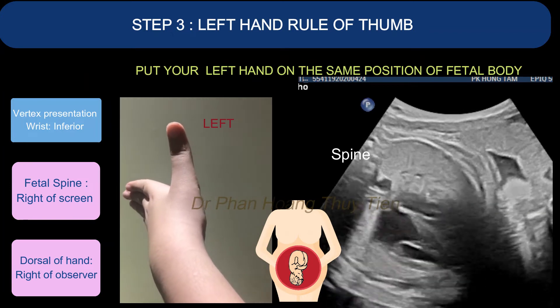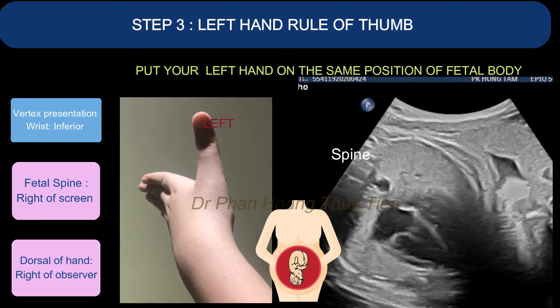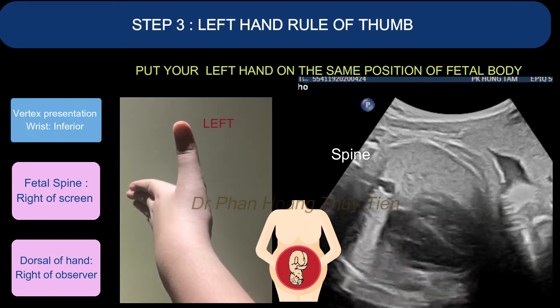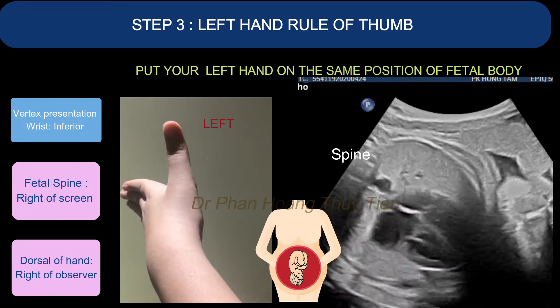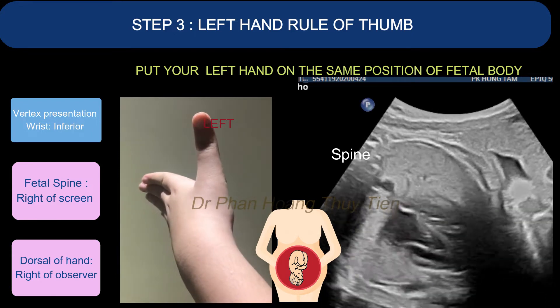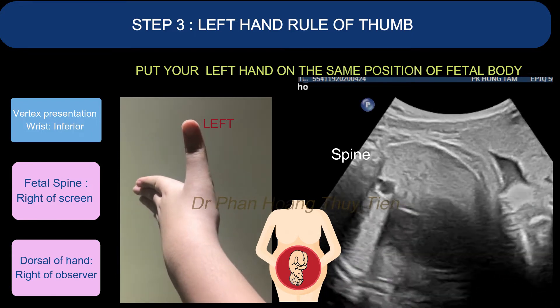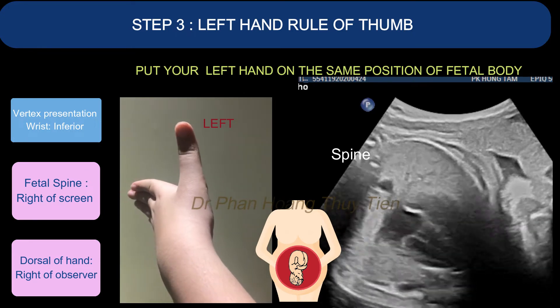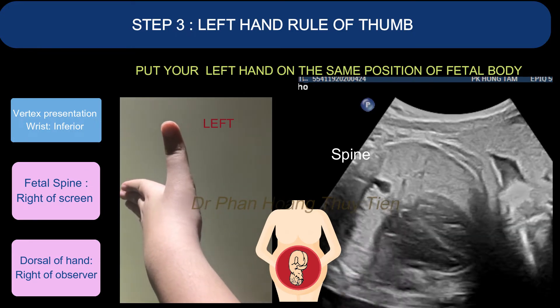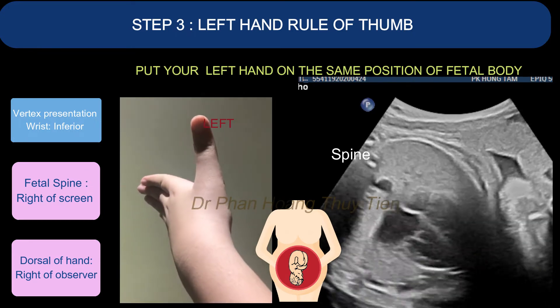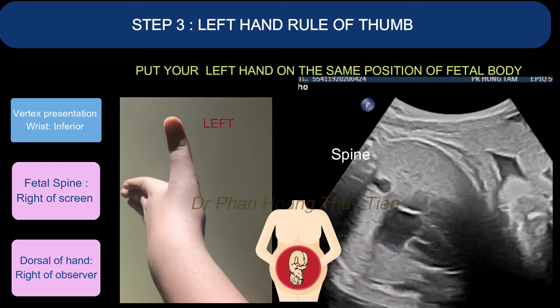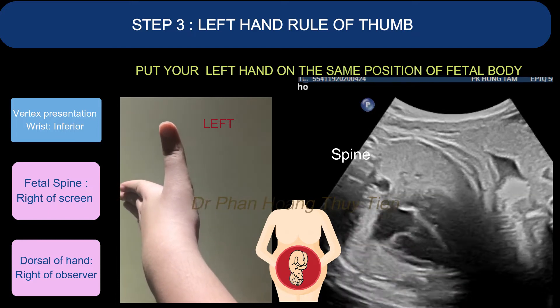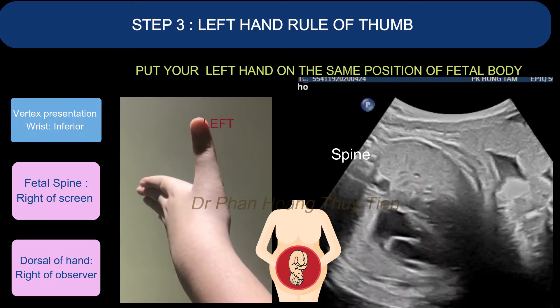please remember that since this is a vertex presentation, the wrist — which is the fetal head — will be inferior. In this example, you can see the fetal spine is at the right of the screen, so your hand dorsal will also be on the right of the observer.